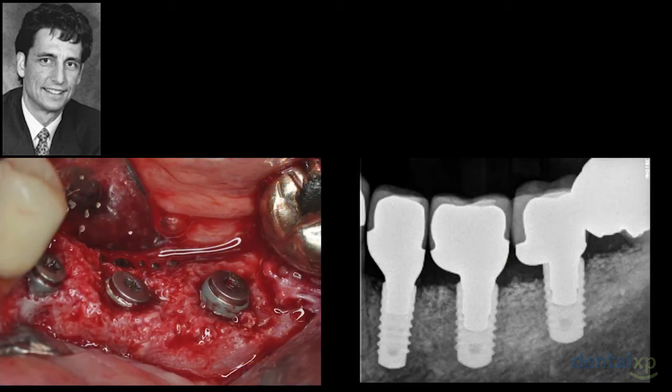So this shows the implants being placed on that case. We went ahead and did a contour graft on this region because of the narrow nature at this region. The mesh, as it comes into that natural tooth, was a little limited in the dimension in the horizontal aspect.